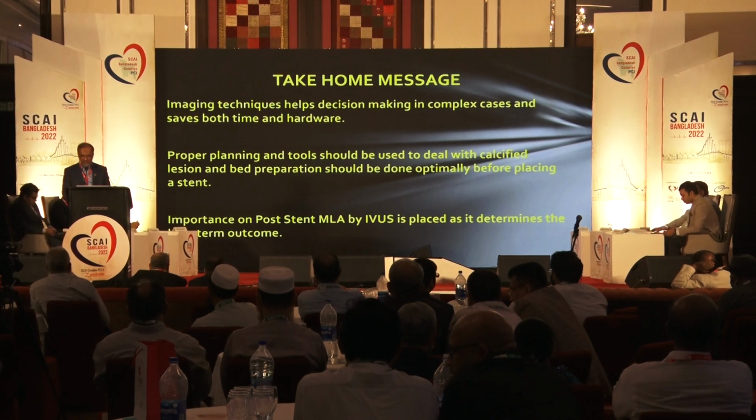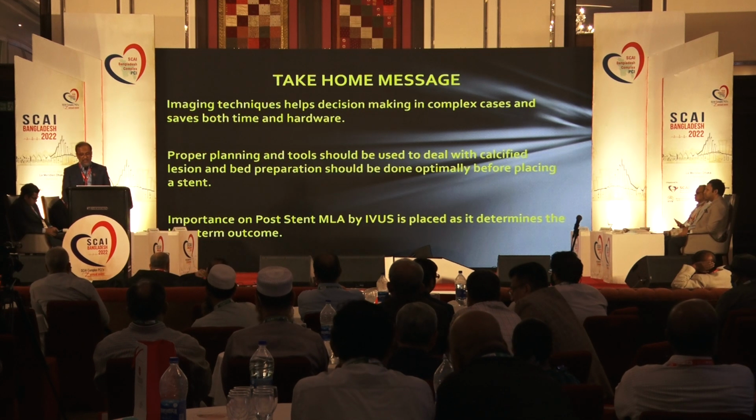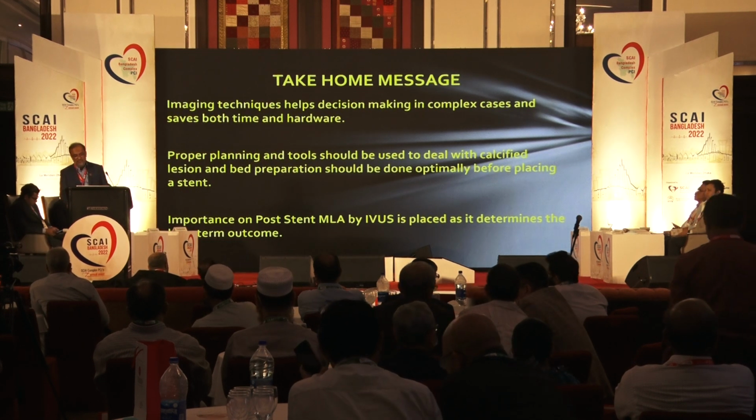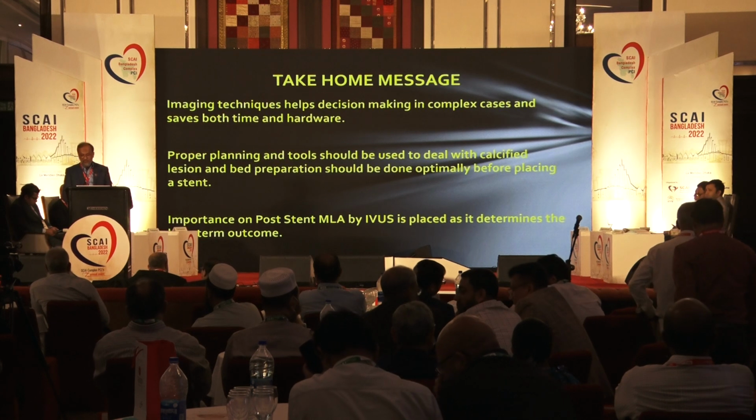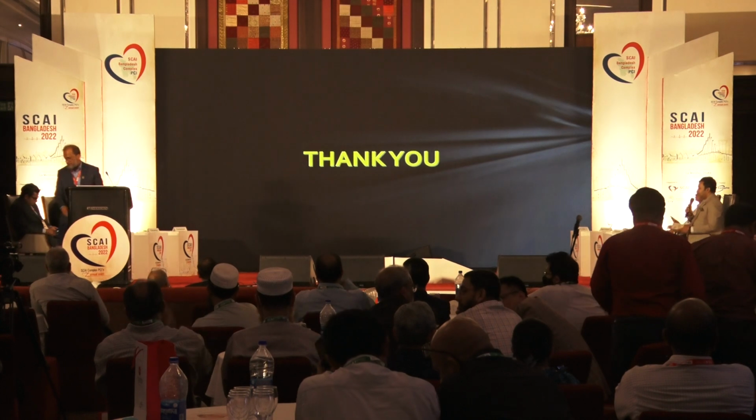It's better to do it and send it to some center for rotation. And importance on post-stent MLA by IVUS is placed as it determines the long-term outcome. And this is the algorithm we don't know. Thank you.